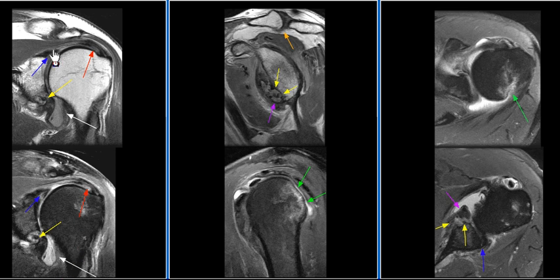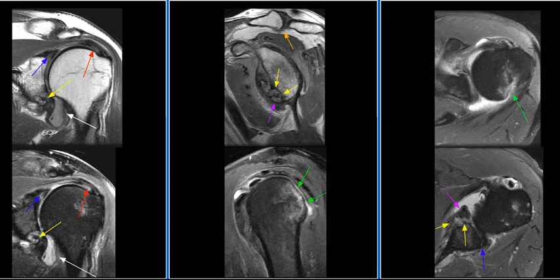The labrum is abnormal, including an extensive tear of the anterior labrum, a SLAP tear of the superior labrum, and fraying of the posterior labrum.